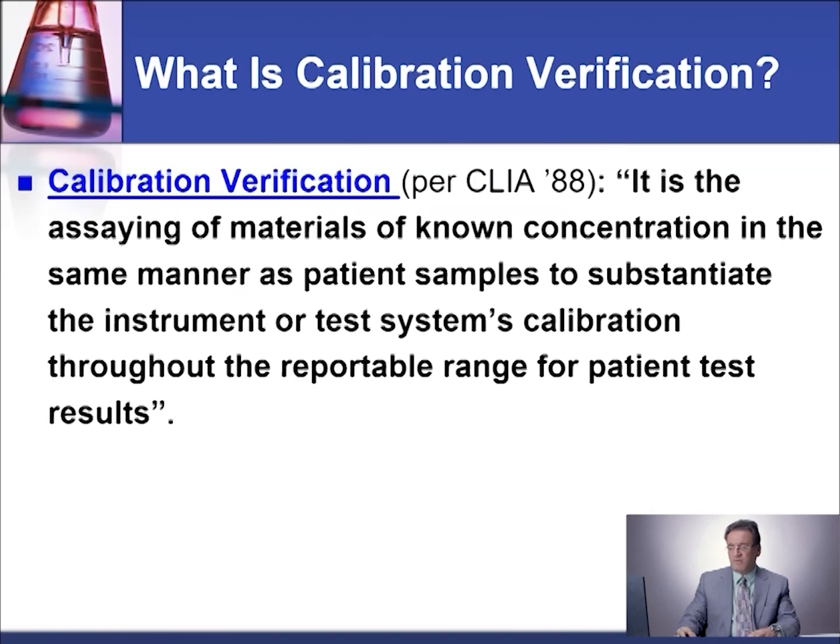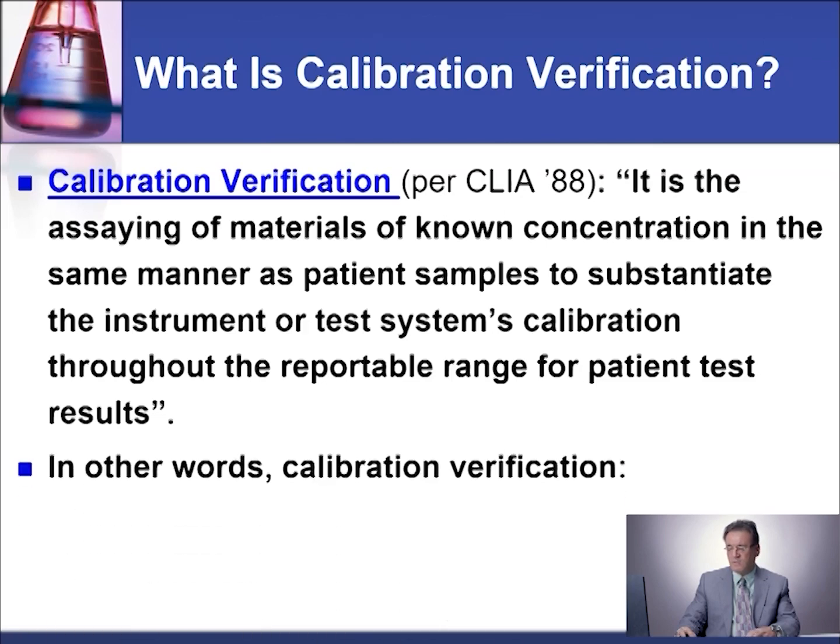What is calibration verification? Calibration verification is the assaying of materials of known concentration in the same manner as patient samples to substantiate the instrument or test system calibration throughout the reportable range for patient test results.